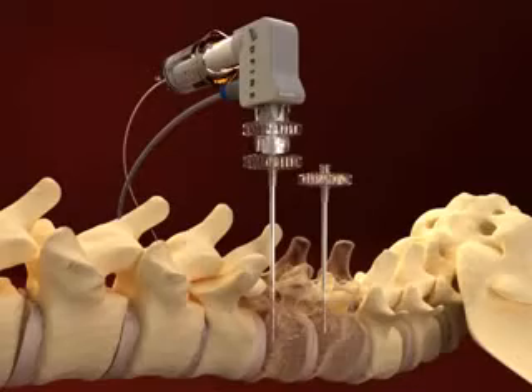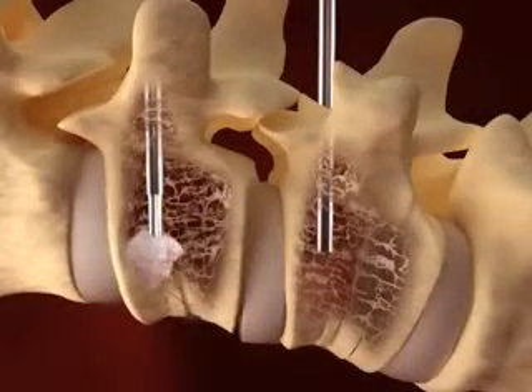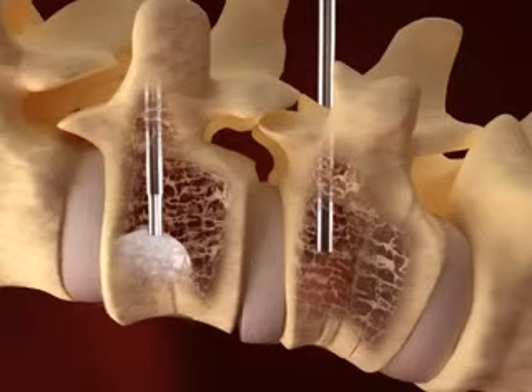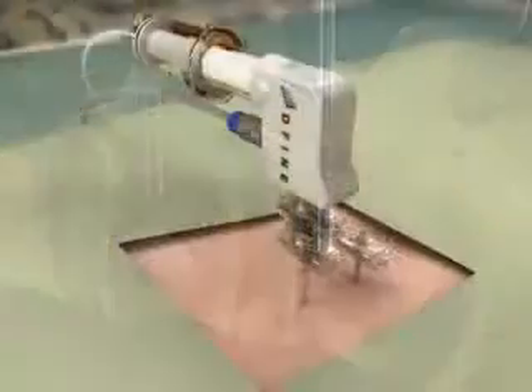After delivering an optimal amount of ultra-high viscosity Stability ER bone cement, the physician will then remove the delivery cannula from the working cannula by simply unlocking it.